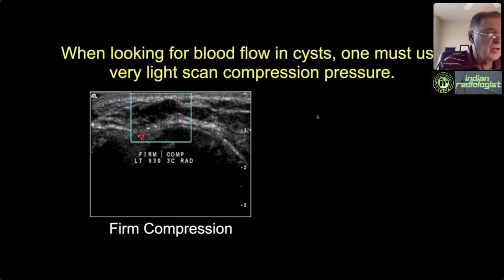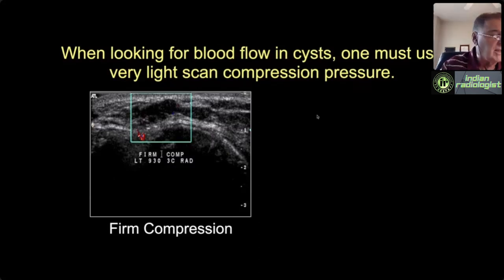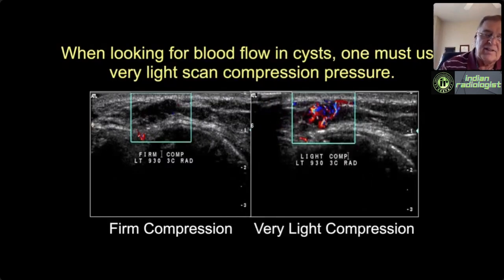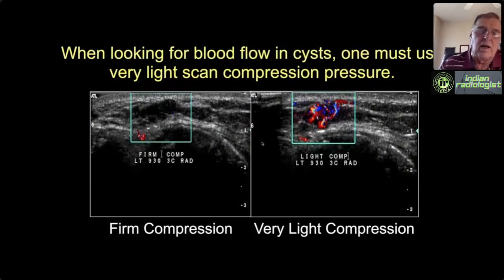An important caution: if you use too much scan pressure, you can create false negatives by shutting the tumor vessels off. Tumor vessels don't have muscular or elastic walls and are easy to compress. Here, just letting the weight of my arm rest on the transducer gives a false negative. On the right, consciously lifting up on the probe so I'm barely touching the skin—you can see tremendous vascularity. So if you're going to use Doppler and want to minimize false negatives, you must use very light scan technique. The literature hasn't emphasized this enough.